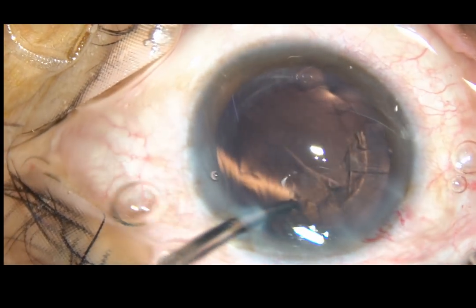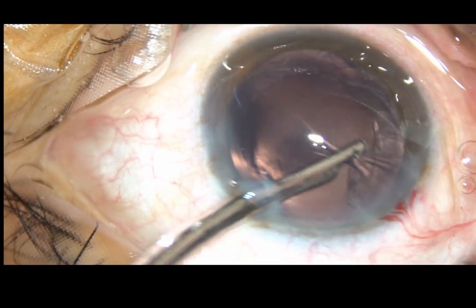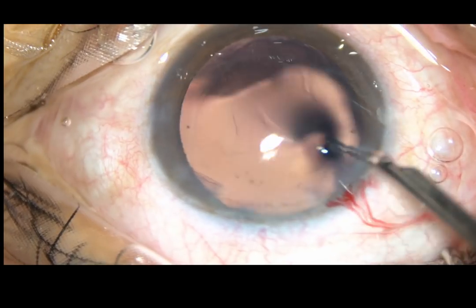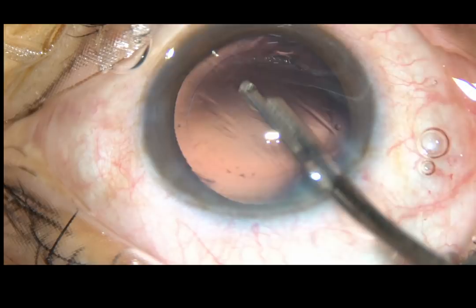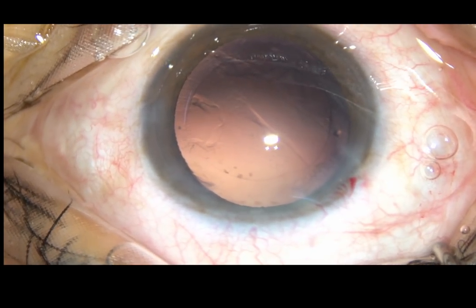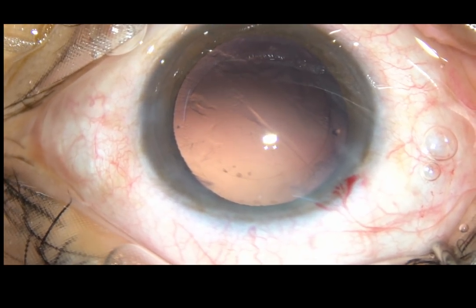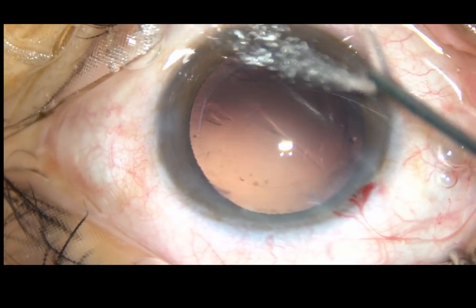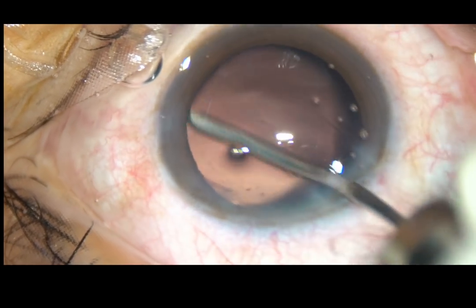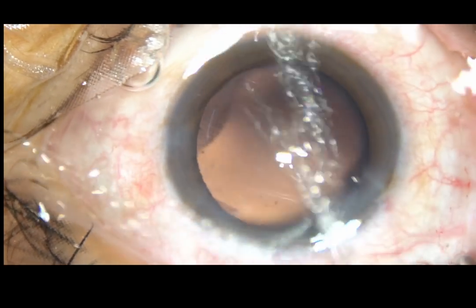Now, with the 23G SIMCO, the sub-incisional cortex is removed going through the left side port. The cortex has been removed. Now, the posterior capsule is polished with the help of this irrigating probe of bimanual IA.